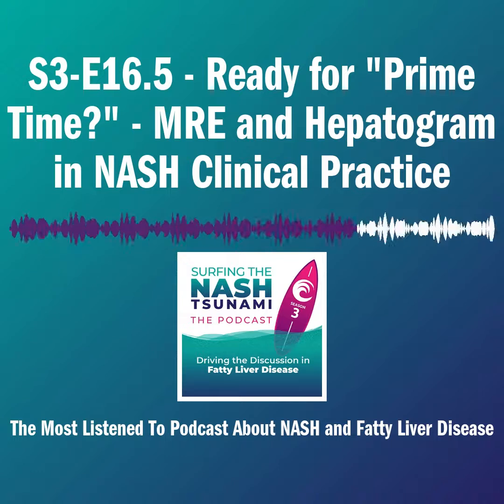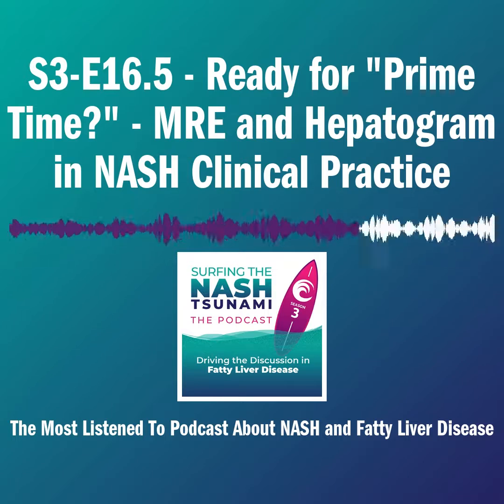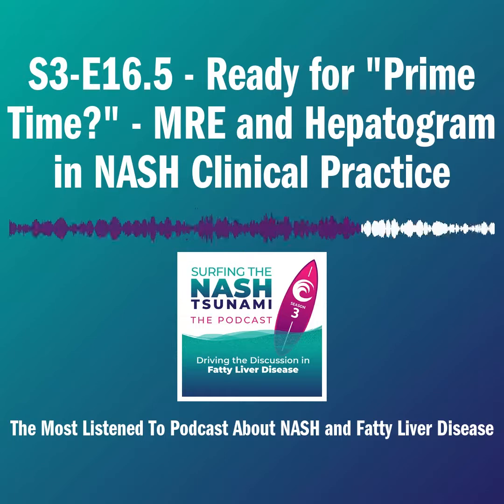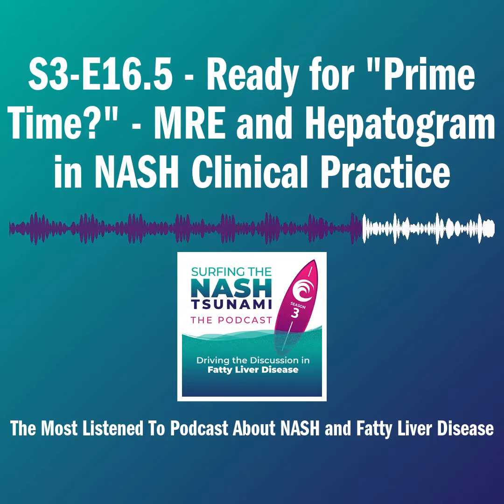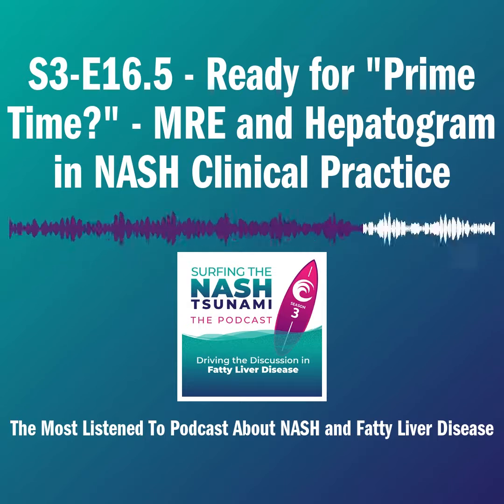The one thing I want to emphasize, and that's why I jumped to answer first, is that the FDA actually is not looking at correlation between MRE and liver biopsy. The FDA has moved the needle now and is really specific about MRE or any NIT changes. I assume at the end of the day, it will be a combination of two or three NITs put in a small pot to enter patients in a phase 3 trial and see the changes over time. But for those to make it to the finish line, the FDA wanted an outcome study, or correlation with outcomes, showing that we're not sure yet.